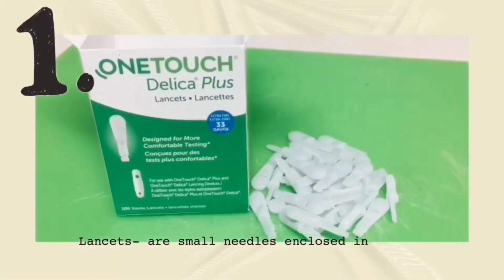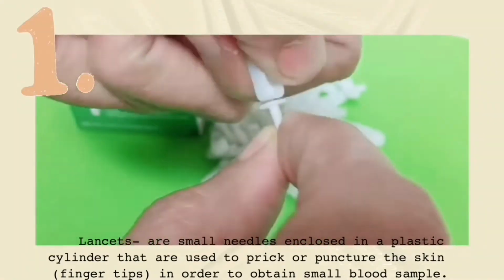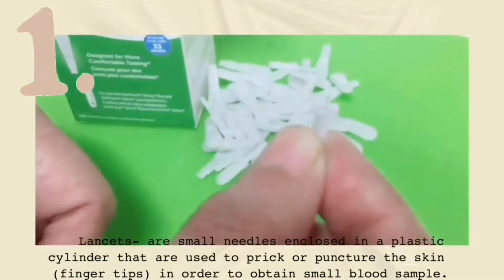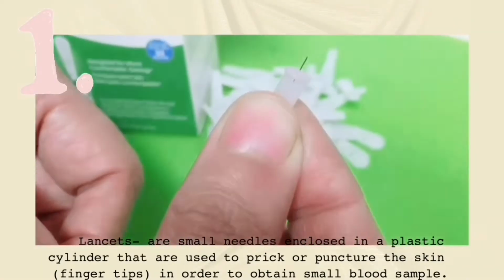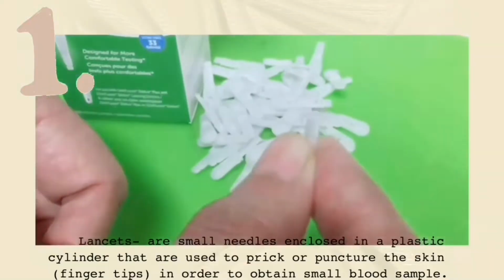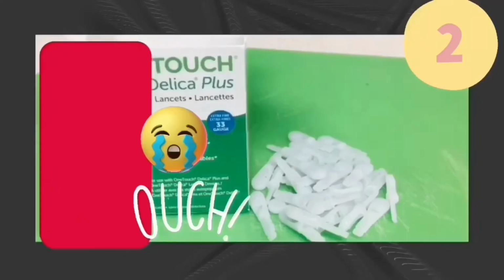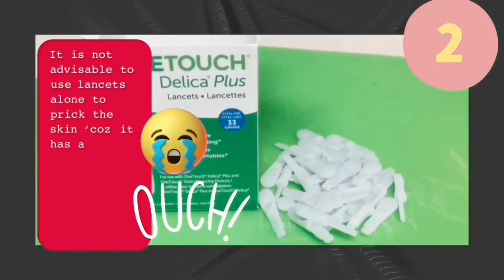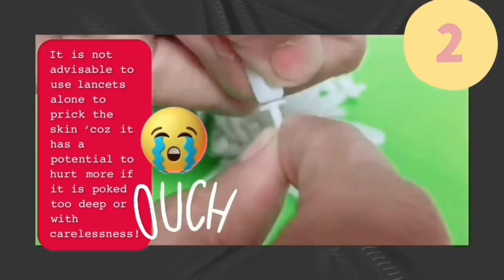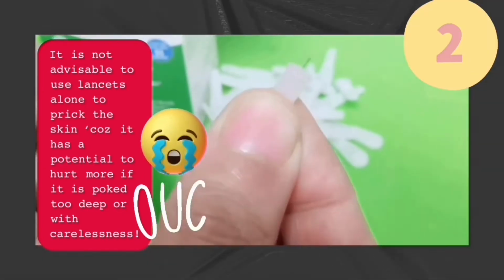So, the first supply we're gonna need is lancet. So, what are lancets? Lancets are small needles enclosed in a plastic cylinder that are used to prick or puncture the skin, especially fingertips, in order to obtain small blood sample. Now, it is not advisable to use lancets alone to prick the skin because it has a potential to hurt more if it is poked too deep or with carelessness.